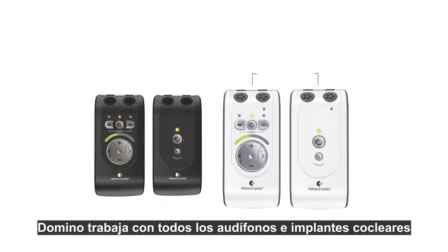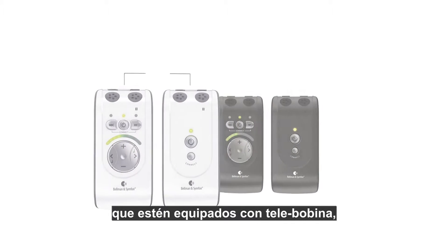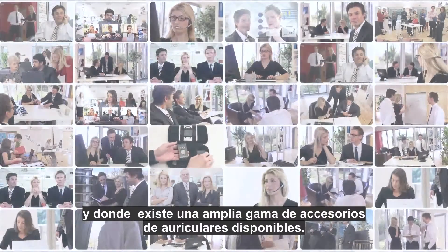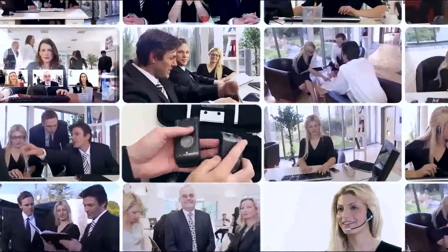Domino works with all hearing aids and cochlear implants that are equipped with a telecoil, but it's also a great choice if you just have difficulty hearing occasionally. There is a wide range of original accessories available.